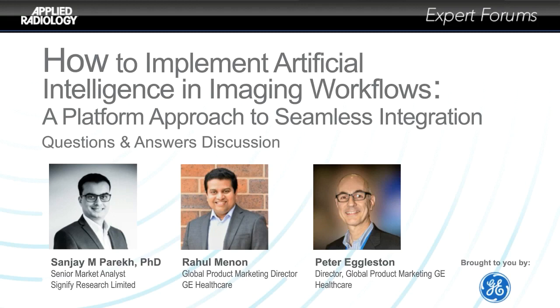Right. So there's geographic locality. Is that vendor in your region? Do they have good presence? Are they certified via a regulatory body in your region for use? Here, of course, in the U.S., that's the FDA. Do they have good reader studies? Do they have a good body of evidence? What we do when we work with vendors is we first put them through a first pass at looking at all of that, and then we prioritize those vendors for working with.